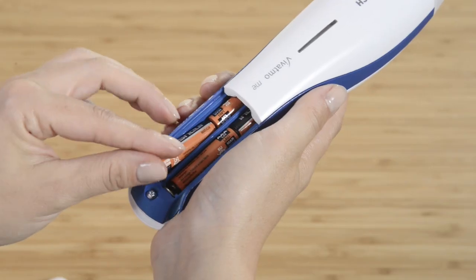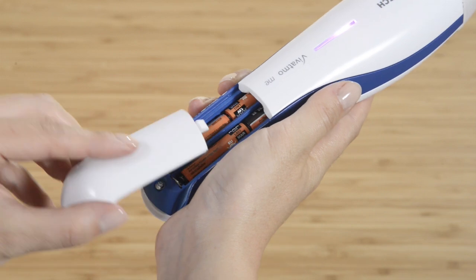Extremely simple to use. First of all, insert the four batteries into the battery compartment and press on.